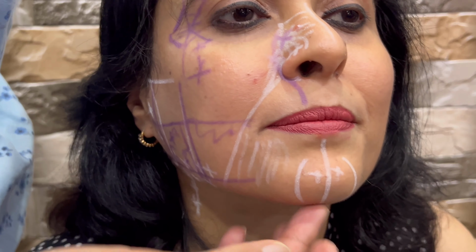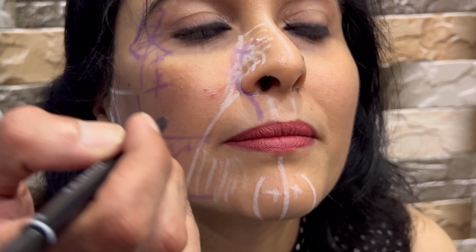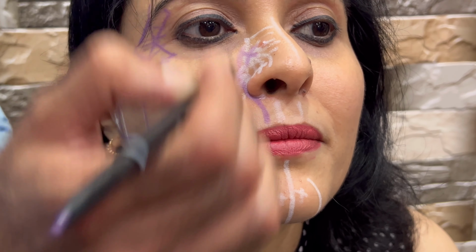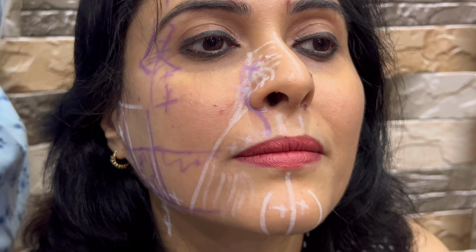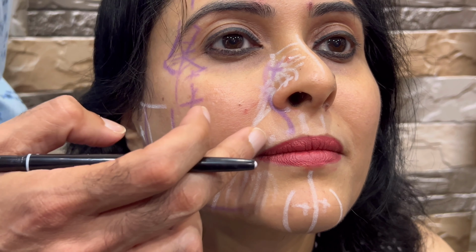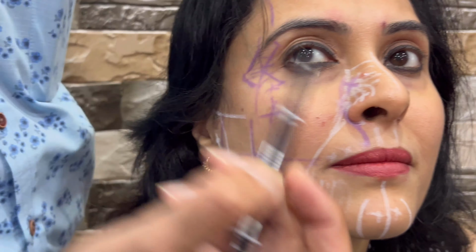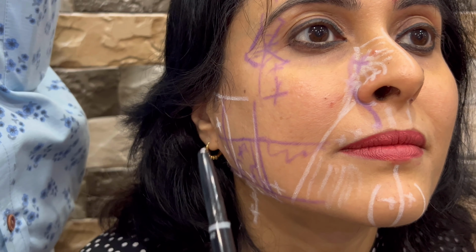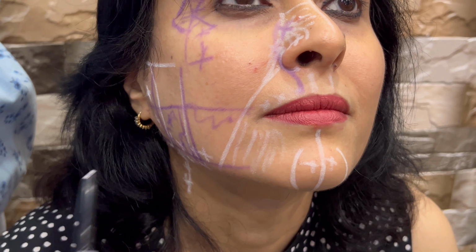What you also do, lift up, you mark the philtral column. The philtral column would be here and the philtral column would be here. And then on either side, you can do a lip flip also along with that. So you put 1, 1, and 1 unit here, here, here. Each point. Okay, but here you'll have to be careful. Because the levators are inserting into the skin. So when you're relaxing here, you're relaxing the lateral levators. But for most gummy smile corrections, smile, the gummy pull is in this midline here in this area. It's not as much as here.